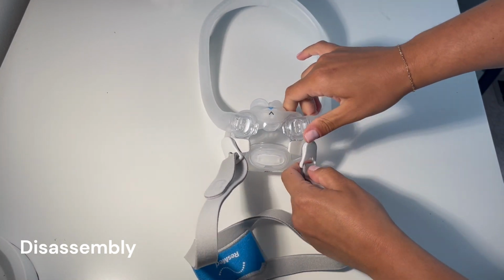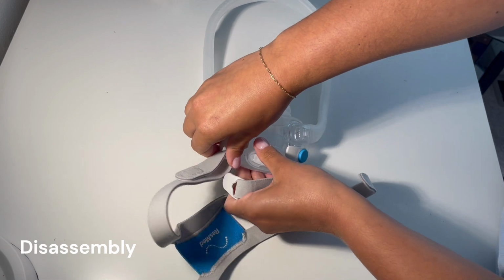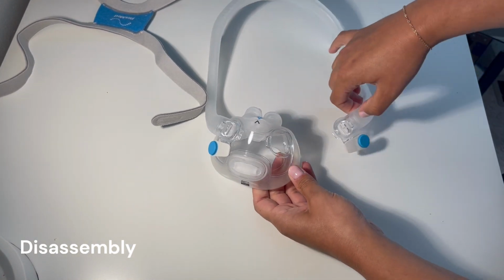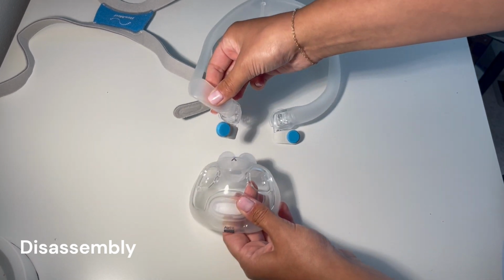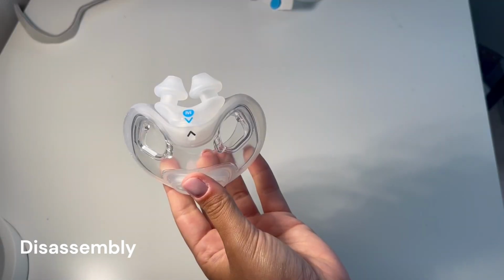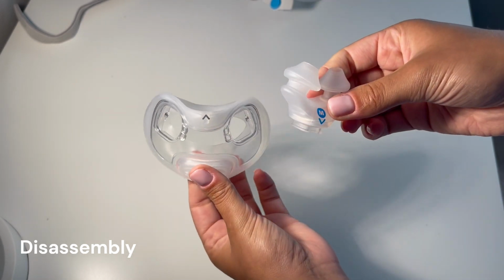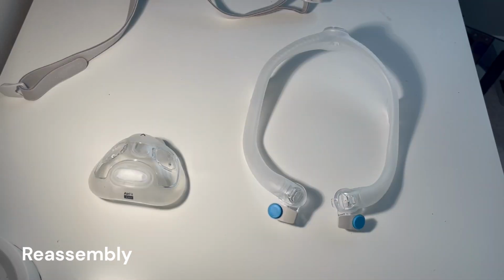Gently take the bottom magnetic tabs away from the mask. Grip the frame connector and lift the frame to unclip from the cushion. Repeat on the other side. Then, pull the pillows away from the oral cushion. And now your mask is ready to be cleaned or replaced.